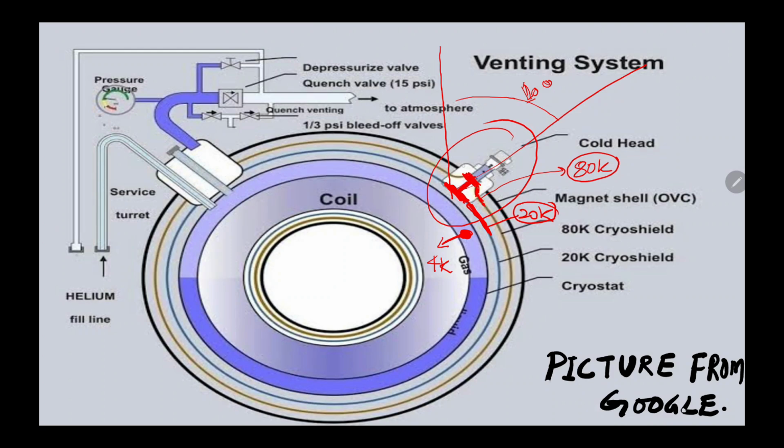So because of these two connections, stage 1 and stage 2, the internal atmosphere stays at 10 Kelvin. Okay, so the helium is in a 4 Kelvin state, and also we are establishing a 10K environment here, so the loss will be very less. So this heating will not go out so easily.